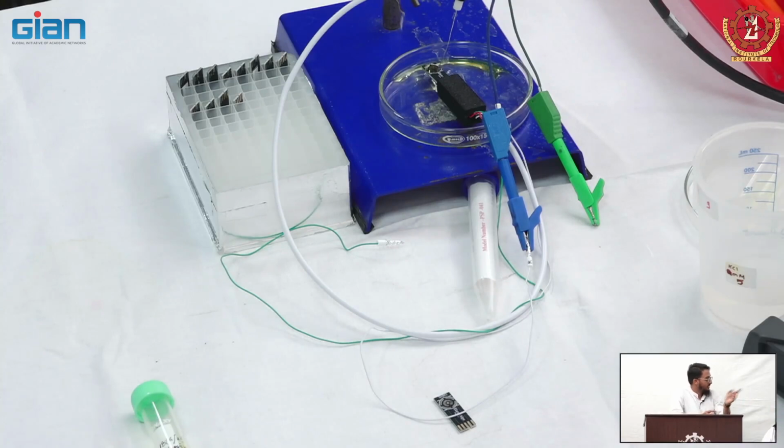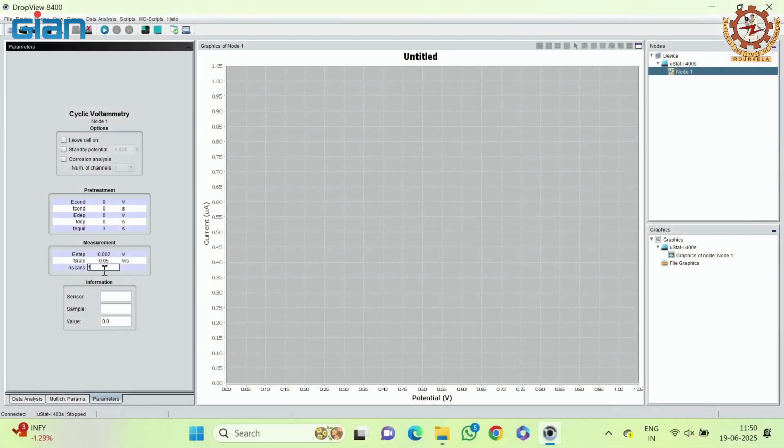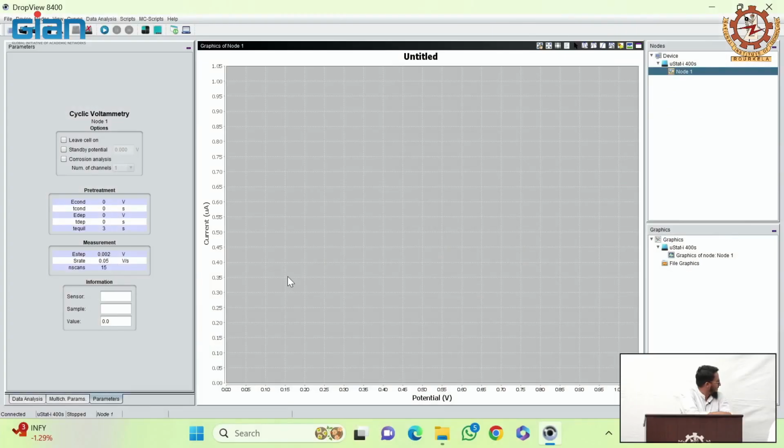Can we switch to the screen? Yeah, done. Ready? So now we are going to set the CV parameters for the electropolymerization step. We go to select CV, then we will set the number of scans, which is 15. Scan rate will remain the same, E step will remain the same.